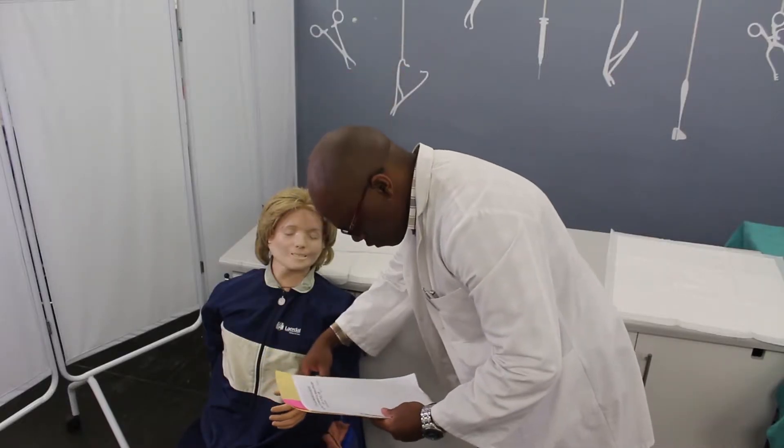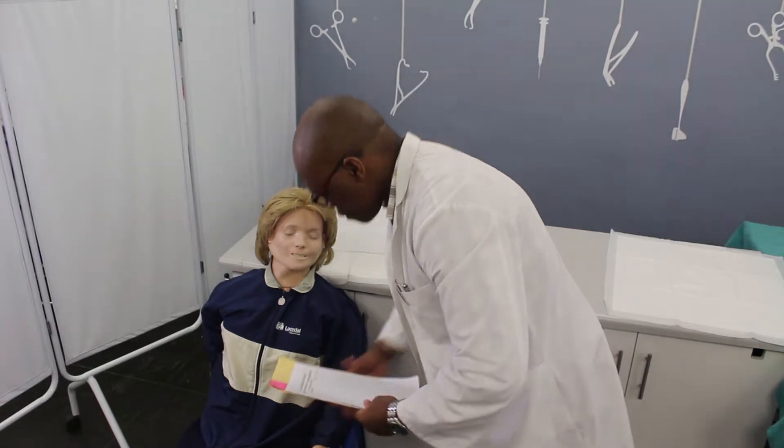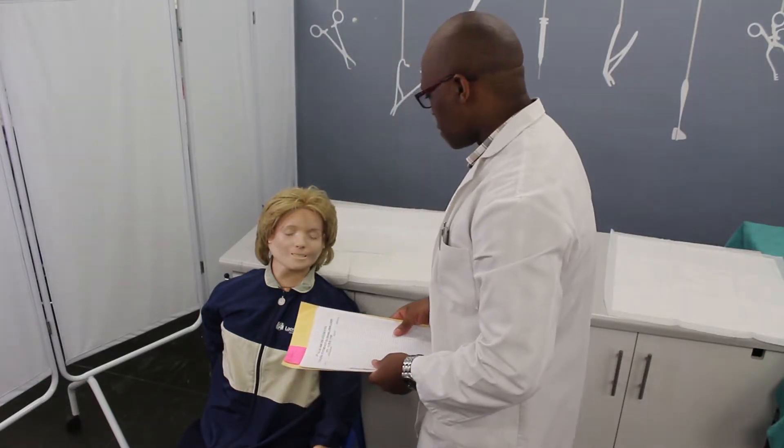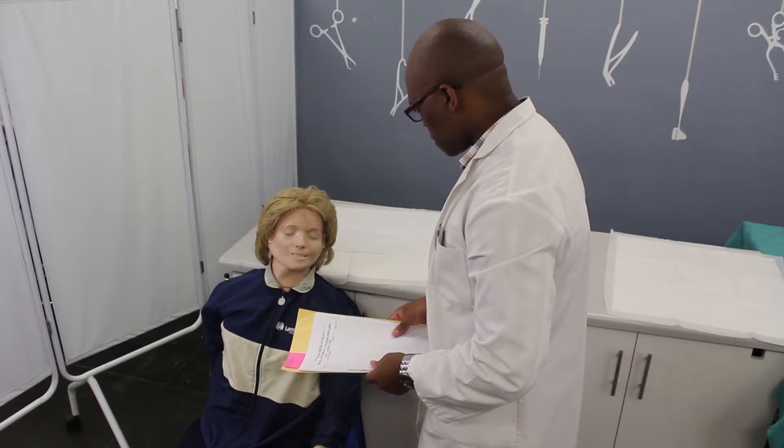Greet the patient and introduce yourself. Confirm the patient's identity by asking for his or her name and checking the armband. Explain the procedure and ask whether the patient has allergies, concerns or questions. Obtain verbal consent from the patient to perform the procedure.